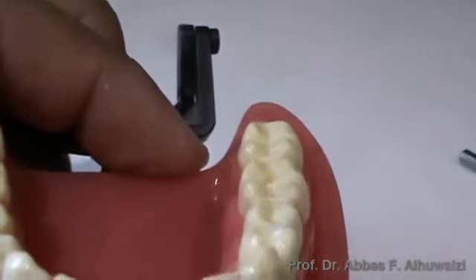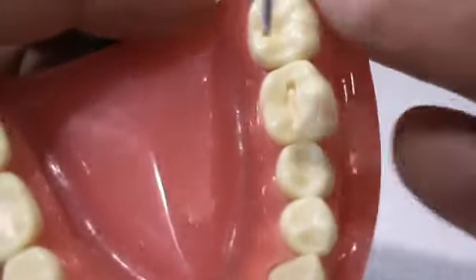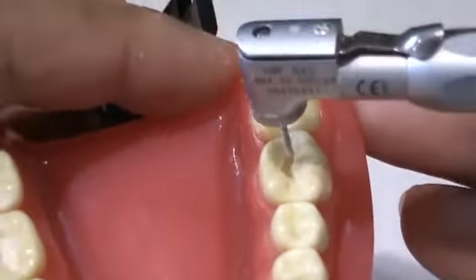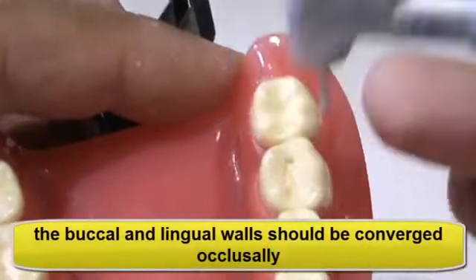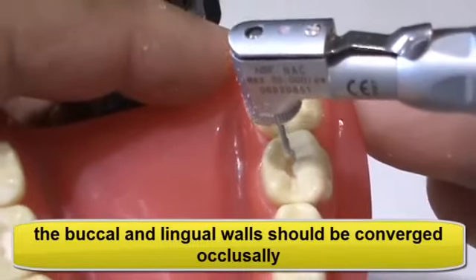about 5 degrees. This is done by tilting the fissure burr and cutting under the cusps.